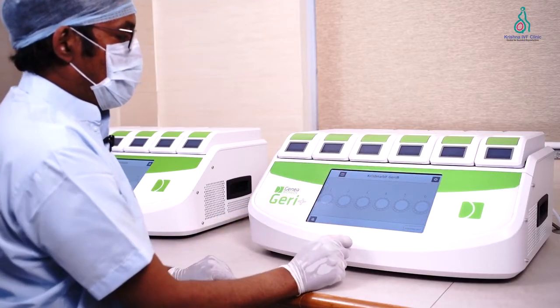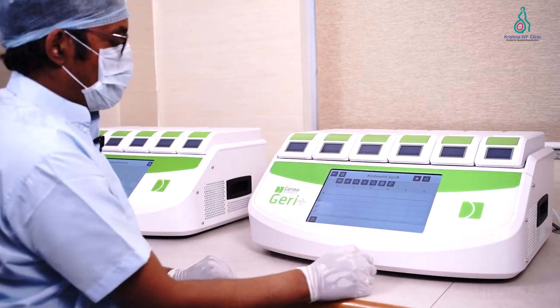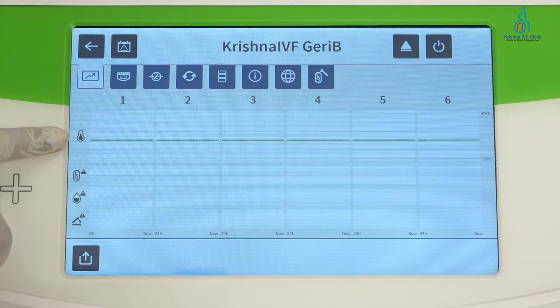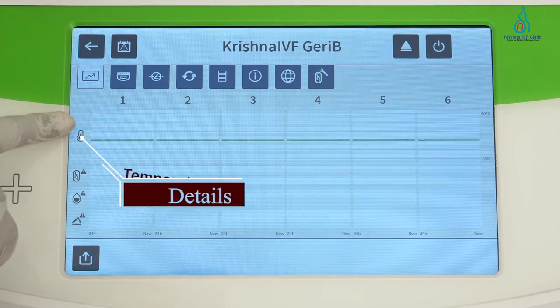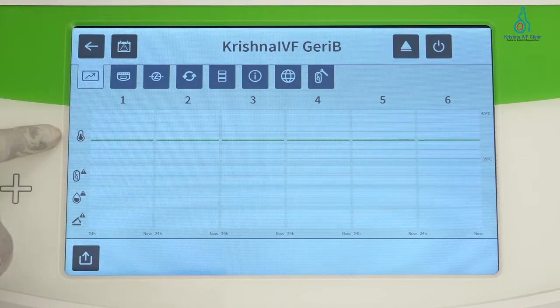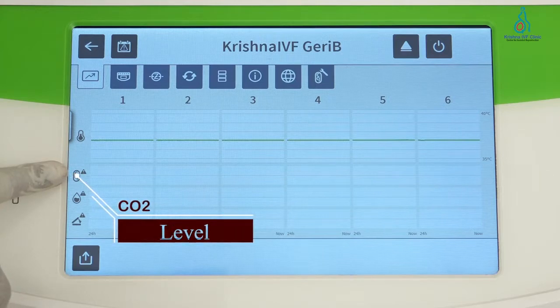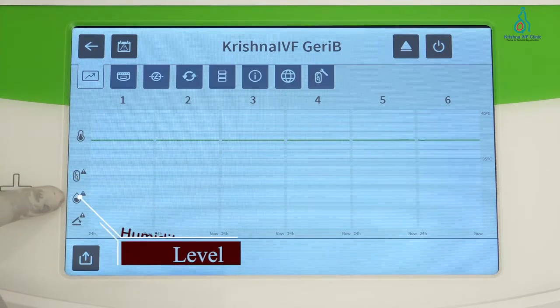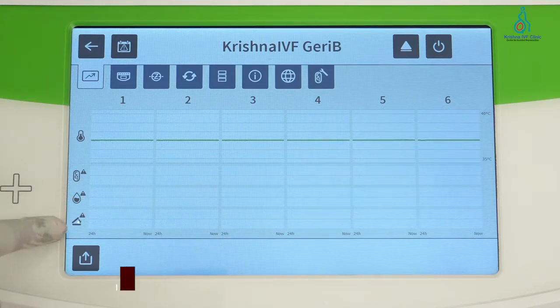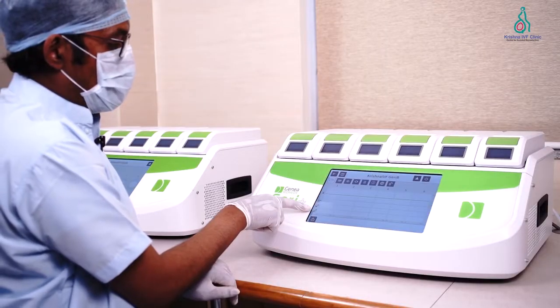Now we will go back — this is the customized settings screen. Here we are seeing the graph for the temperature for each chamber, then the CO2 level for each chamber, the humidity level for each chamber, and the last one is for the events for the lid open of each chamber.